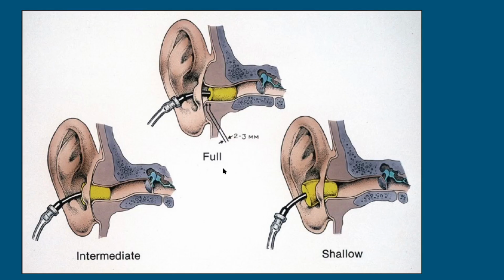So sometimes you can't control the insertion depth due to patient anatomy or comfort. Smaller pediatric inserts do not seem to solve the problem entirely. What I mean by that is if you had a shallow insertion in an adult, you might think, well, let me use a smaller pediatric insert. And the pediatric insert will sit in deeper, no doubt about it, but it doesn't necessarily give you a better acoustic seal. That's been my experience.